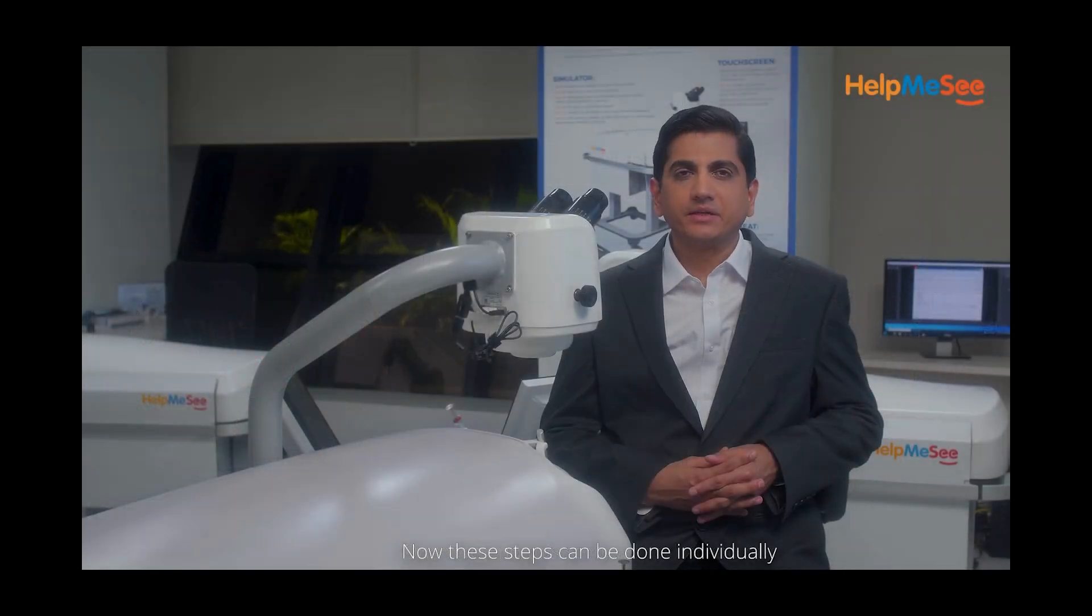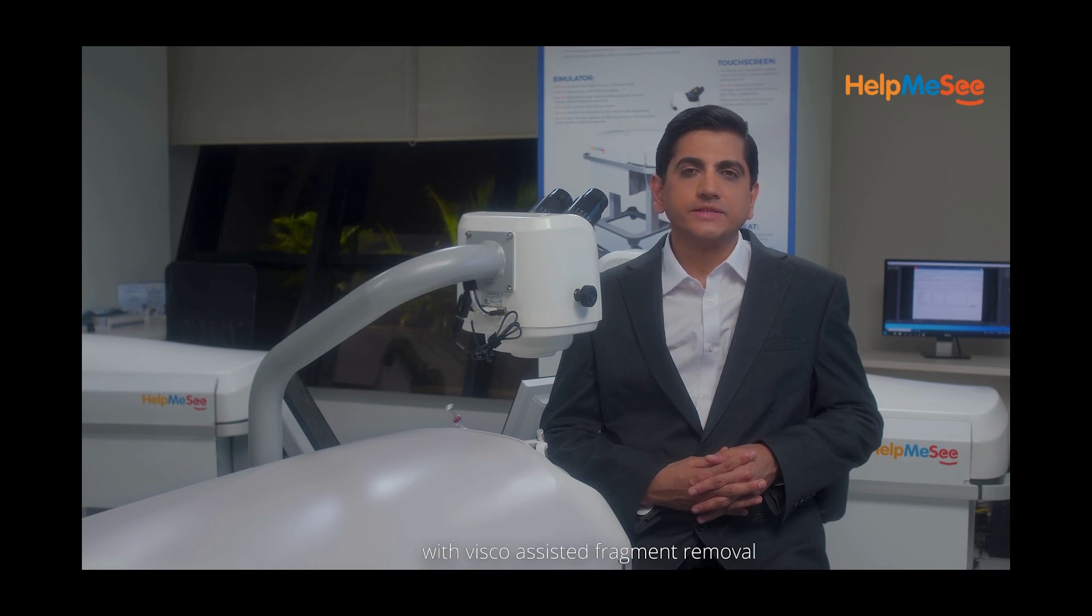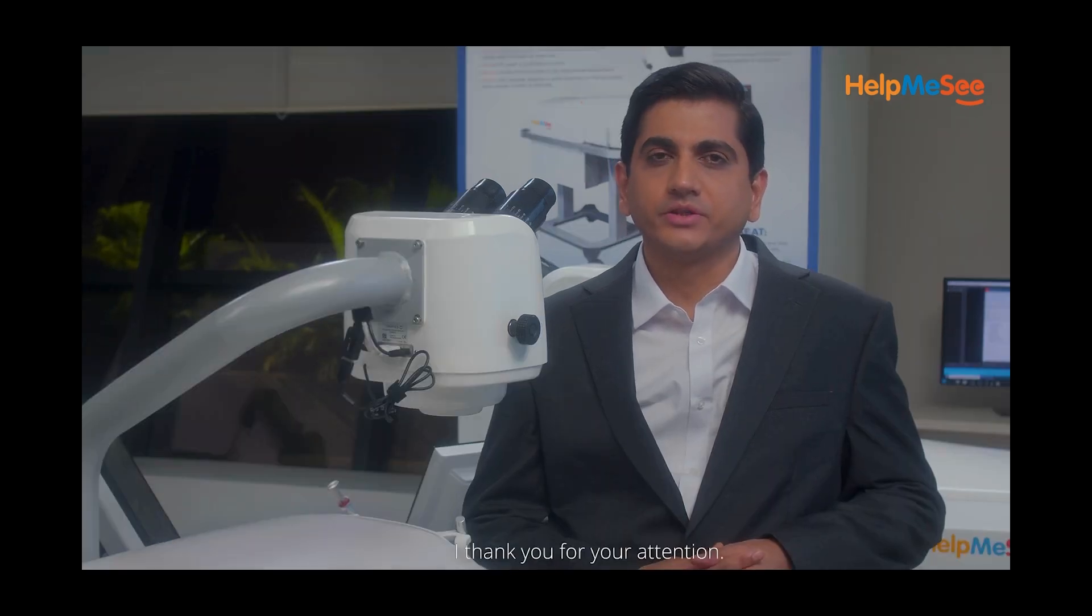Now these steps can be done individually or they can be done in a continuous fashion beginning with visco-assisted fragment removal until the end where you implant a multi-piece lens in sulcus and remove the cannula. This step will help anterior segment surgeons learn the basics of pars plana vitrectomy using the vitrectomy cutter and the irrigation cannula and clean up of the vitreous strands through the pars plana approach as well as through the limbal approach. Thank you for your attention.